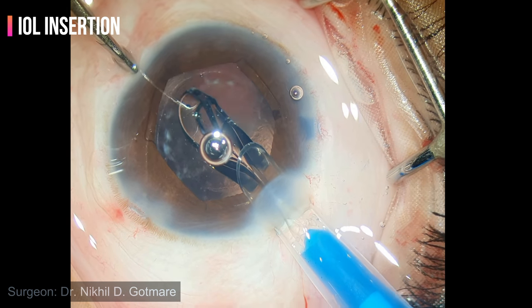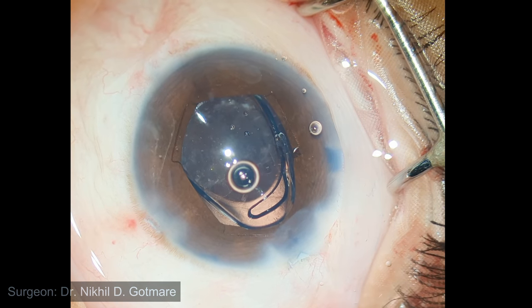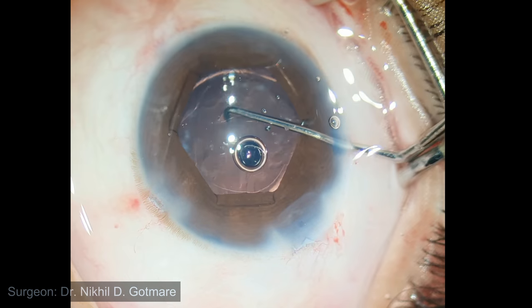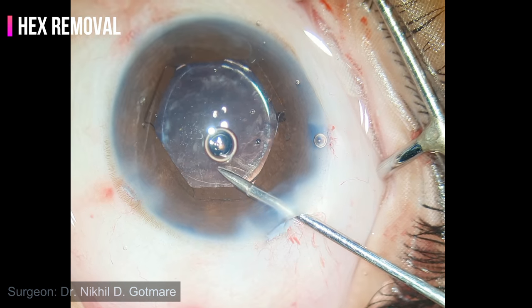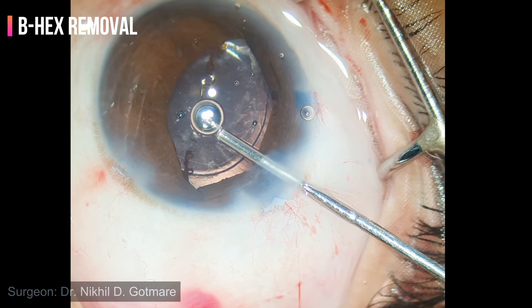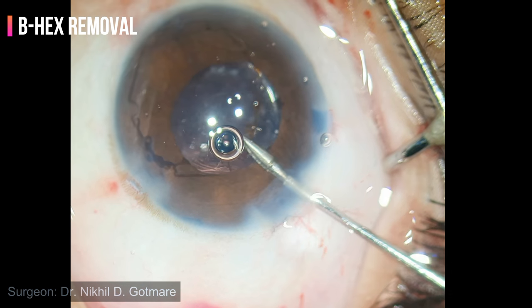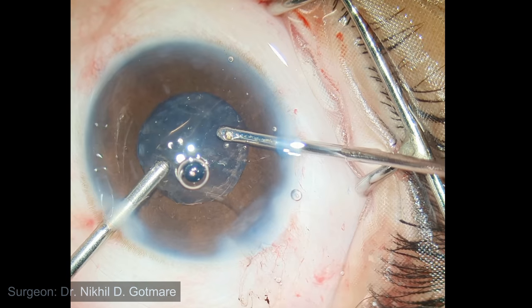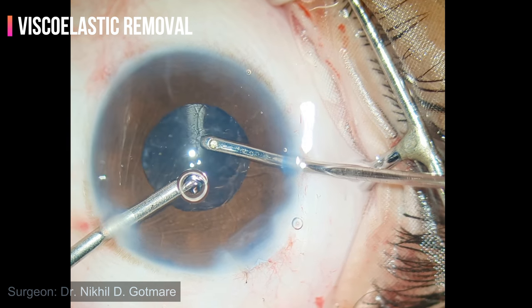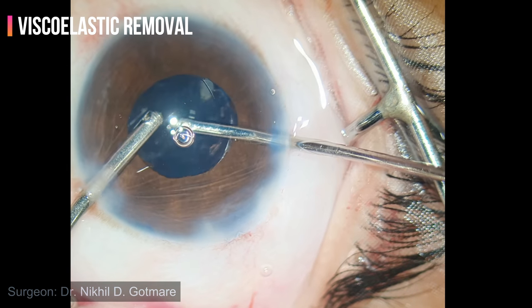A single-piece acrylic intraocular lens is inserted into the bag and dialed using a dialer. Now it's time to remove the B-hex ring — under viscoelastic, hold the flange, pull it centrally, disengage the ring completely, and pull it out. Viscoelastic is then removed. Complete removal allows contact of the posterior capsule with the intraocular lens, reducing chances of PCO.